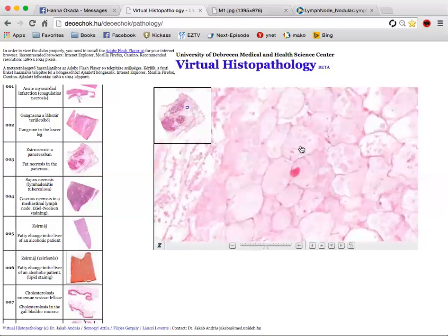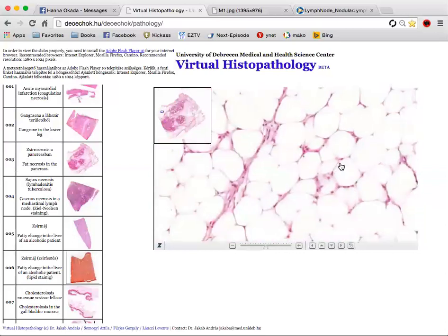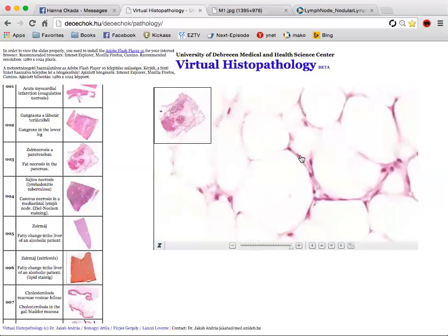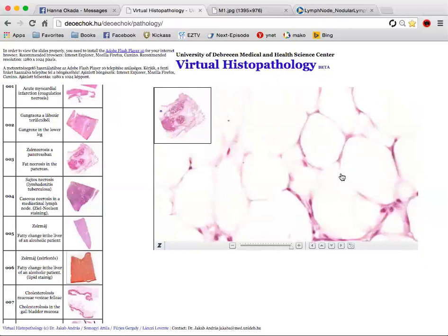So this cell is a necrotic adipocyte, and you said this cell doesn't have a nucleus. But usually adipocytes don't have a nucleus, right? They do. They're live cells, but their nuclei are at the periphery. I'm going to show you normal adipocytes. And you see these. I can't tell you if this belongs to this cell or to the cell next to it, but they do have nuclei. They have an active metabolism, and the nuclei are just at the periphery.